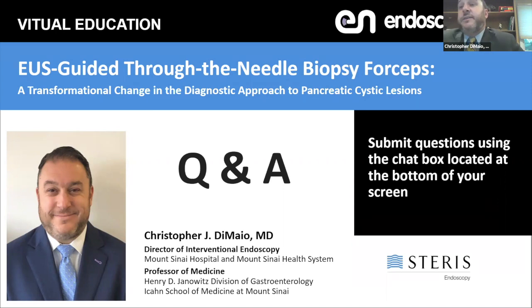But I think if we can continue to show these really fantastic outcomes in making a diagnosis, they should be incorporated, again, not as a mandatory tool, but as something to strongly consider. I'll give you a brief example. In many of the Asian countries, it's sort of taboo to stick a needle in an IPMN because they have a very real concern about seeding. It may just be different biology with that patient population, and a lot of times they're not doing FNA on suspected IPMNs.